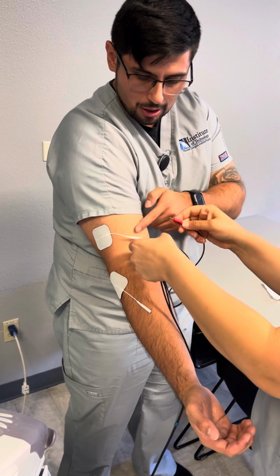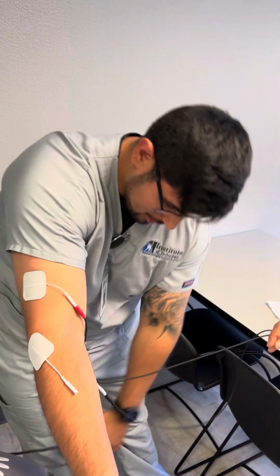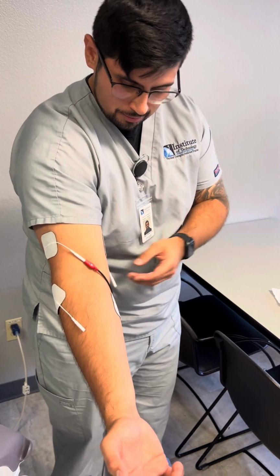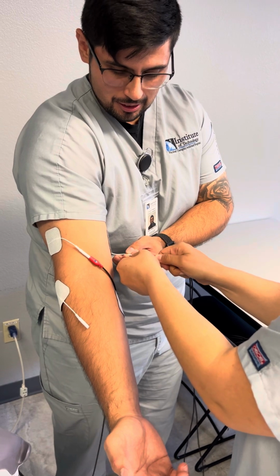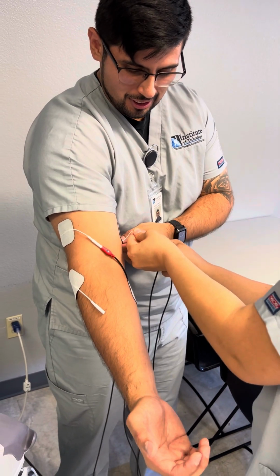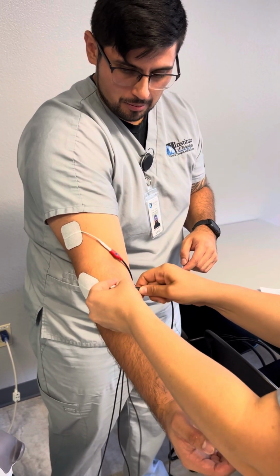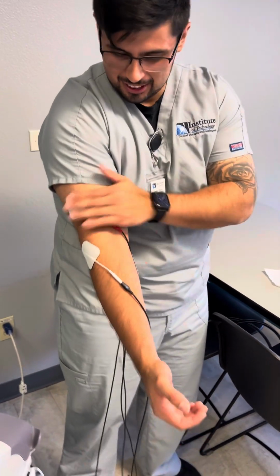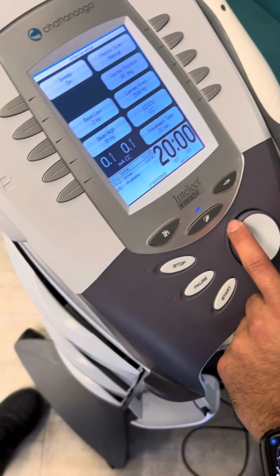And then the other one's gonna go on the opposite end. There. Last one. Thank you.